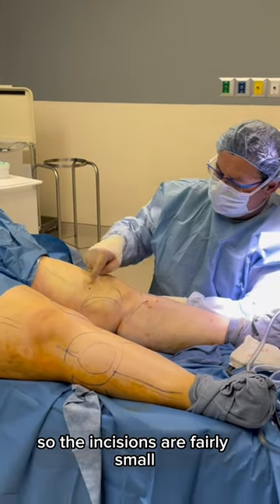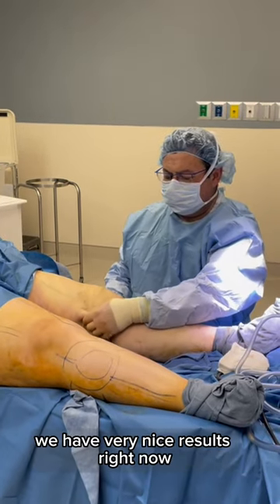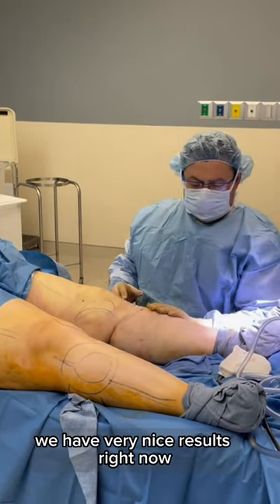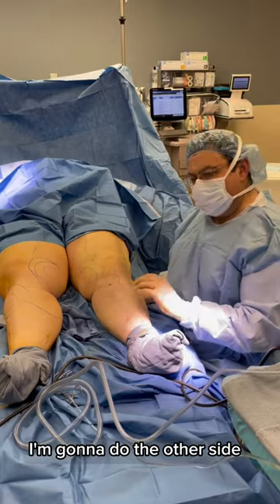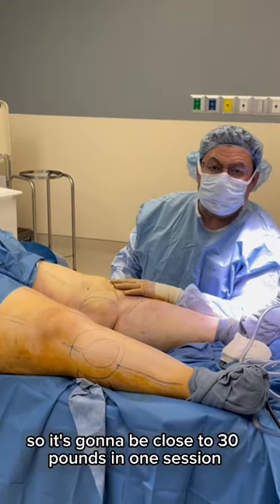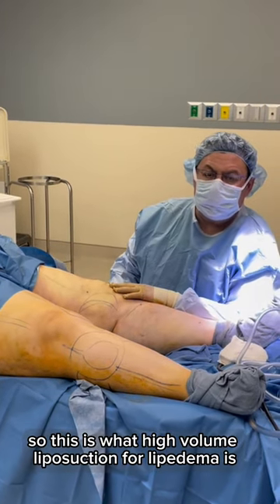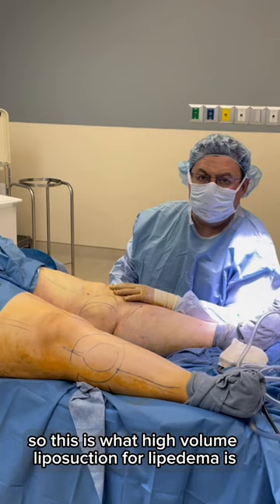The incisions are fairly small — you can barely see them. We have very nice results right now. So we're going to stop, and I'm going to do the other side. It's going to be close to 30 pounds in one session. So this is what high volume liposuction for lipedema is.